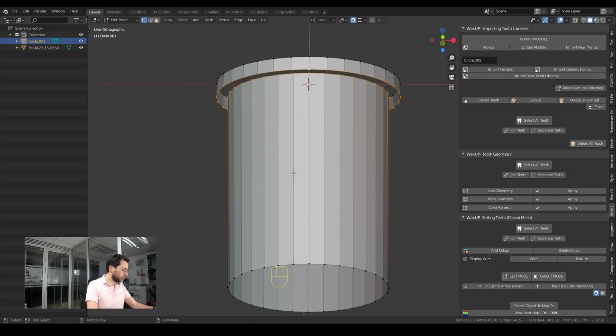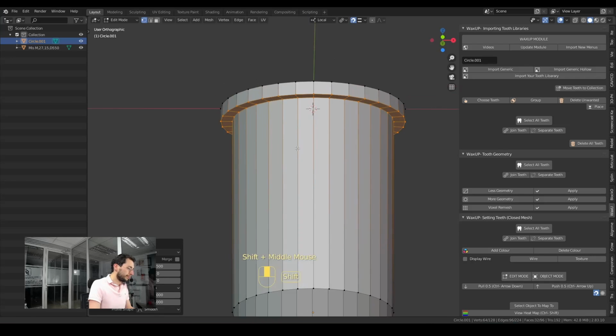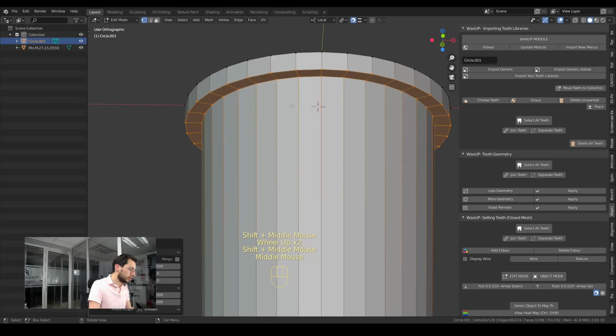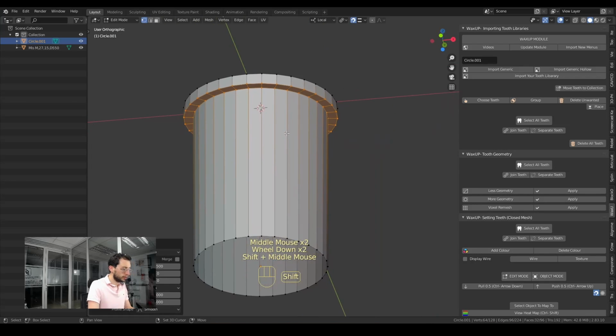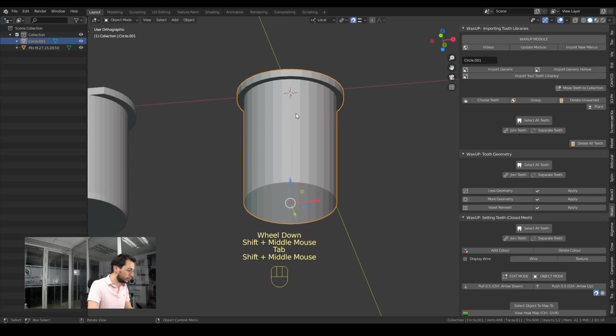Now I'm going to look for an option with F3, which is called Bridge Edge Loops. I can type here Bridge, and it will show under Mesh. So when I click Bridge Edge Loops, that will join or combine those, create a face between those parts.